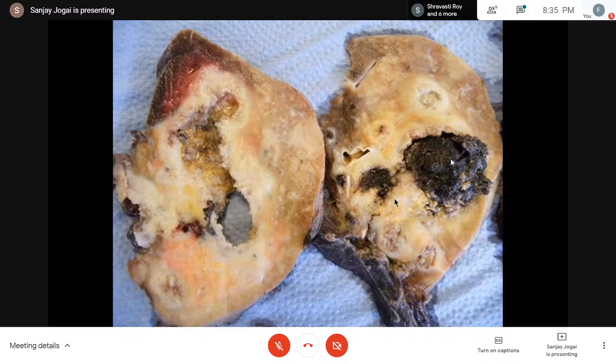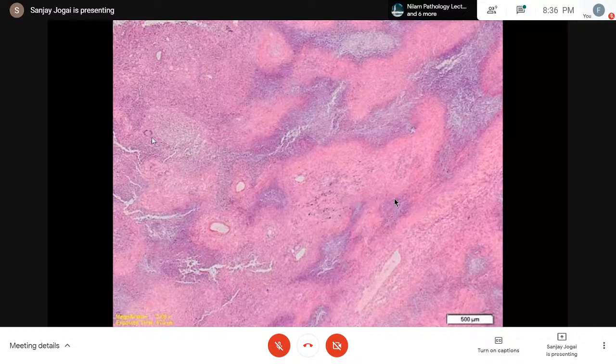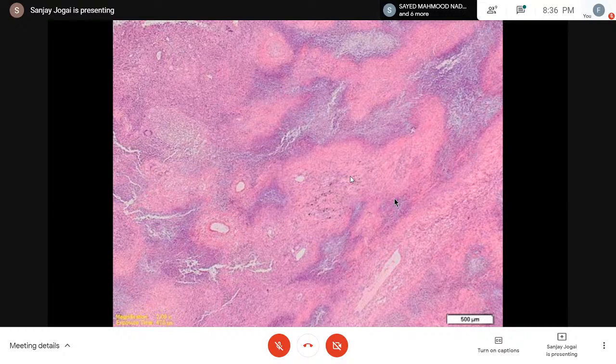And this is microscopy. So the absolute standard teaching, when you see on a scanner a section from the lung which shows this sort of geographic areas of necrosis, which is very blue, purplish blue, there's only one diagnosis that stands out. And often on a scanner you can see these isolated giant cells. Professor Kevin Leslie from Mayo Clinic often says in his talks that the giant cells in Wegener's, or so-called Wegener's, now known as granulomatosis with polyangiitis, are very lonely. You don't see them very well formed in granulomas. They are isolated, they are scattered throughout. So a very good clue to the diagnosis.